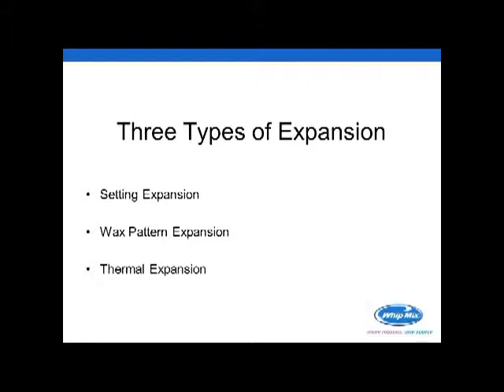Two of them you're very familiar with, and one, it's probably maybe 50-50. Some of you are and some of you aren't, and haven't thought of it before. The first one, of course, is setting expansion. This is the expansion that takes place while the investment is setting up on your bench. The second one is wax pattern expansion, which is something that you're maybe not as familiar with. And the third is thermal expansion, and we're going to talk about all three of these.